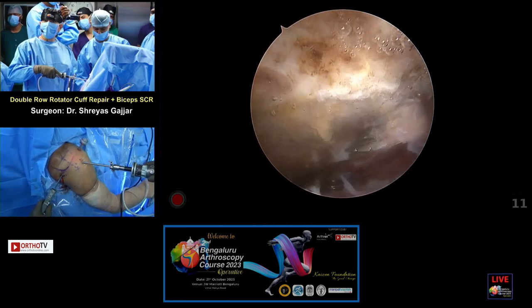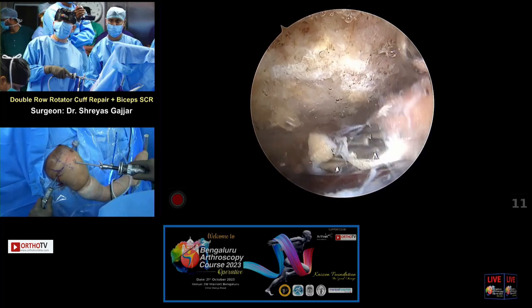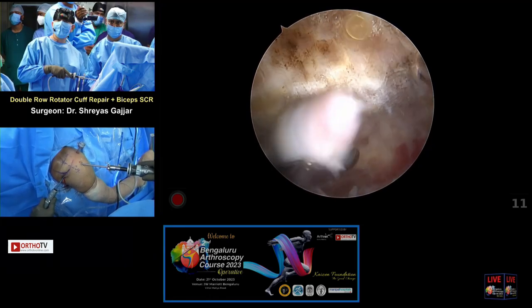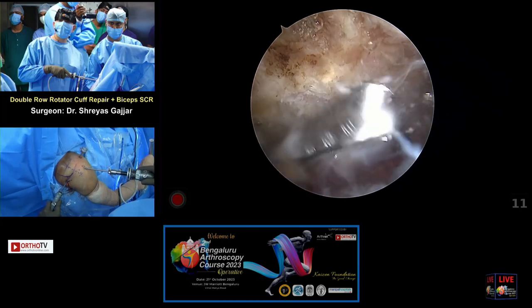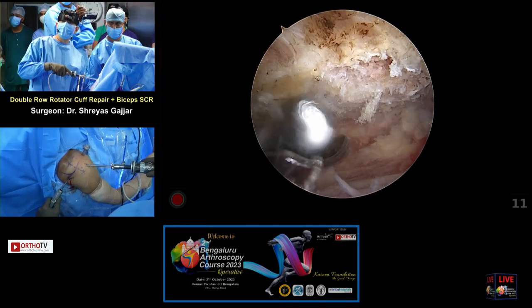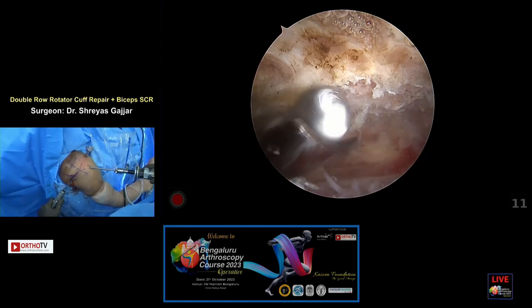So, the cutting block technique, where you just take away a bit of the bone. The tip for beginners is that you start the burr first and then you go in contact with the bone and just take a little bit off. The idea is to have a flat surface and take the anterolateral edge off to prevent any impingement.